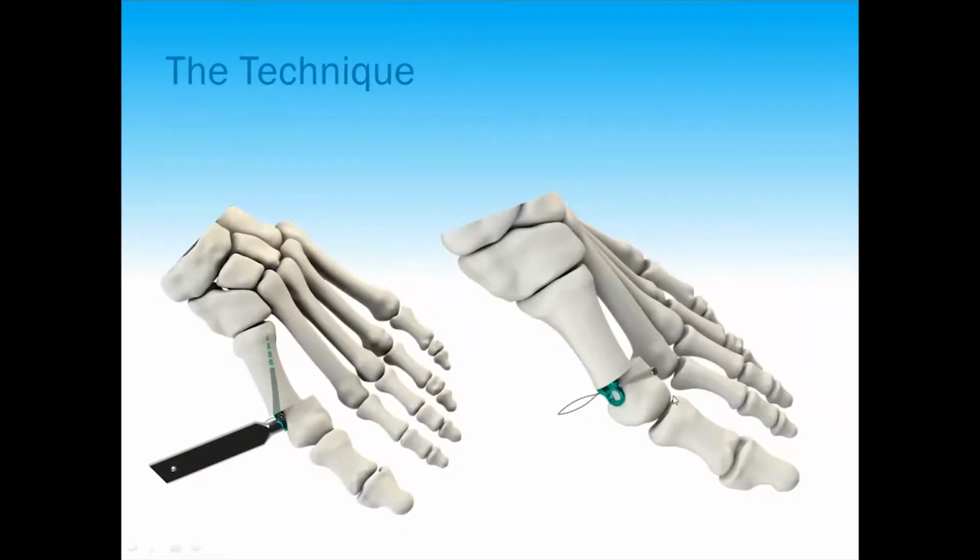It has a handle that you hold on to, that you actually slide in the medullary canal. Pretty straightforward. As you push the head lateral, the canal opens up and you just slide this implant in there. It has, again, the handle which you can do that with. And then that really sets your translation because you can pick your width of the implant. So remember I mentioned that you can pick the length of the implant. You can also pick the width.